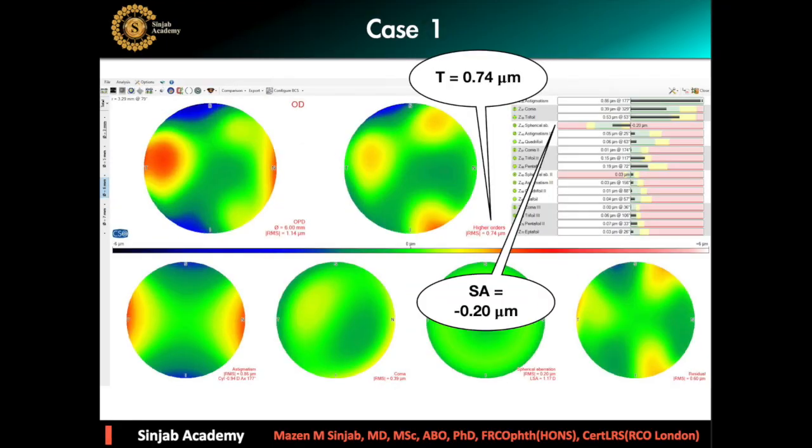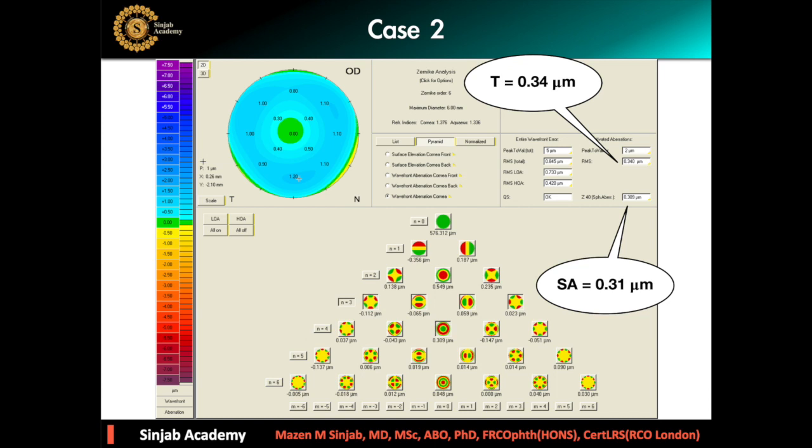So if this patient comes to you and has cataract, and this is his cornea, which lens are you going to implant for him? Are you going to implant a premium IOL? Okay, which premium IOL? Or maybe not, I'm going to implant monofocal. Okay, which monofocal? So as you see, the wavefront is an essential part in the workup for cataract surgery. We are not talking about tomography, which is an essential part as well, but we are talking about wavefront.